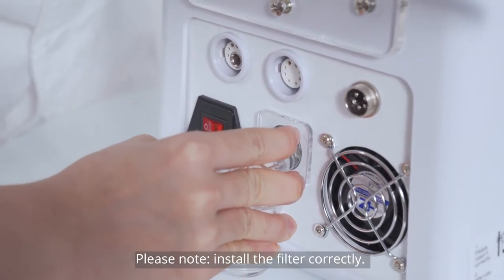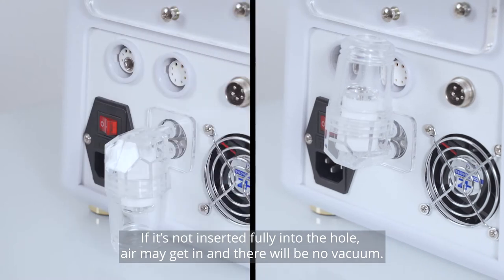Please note: install the filter correctly. If it is not inserted fully into the hole, air may get in and there will be no vacuum.